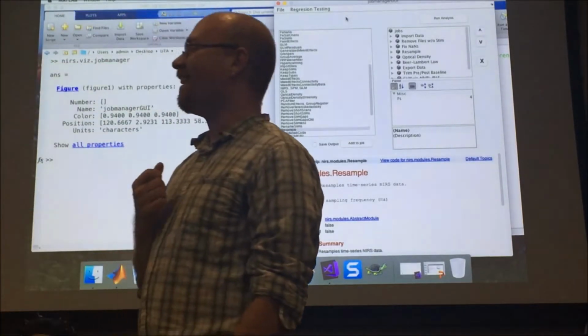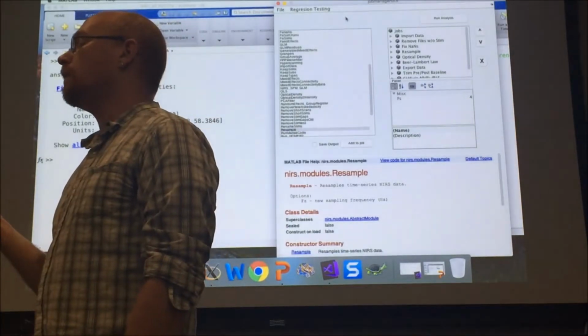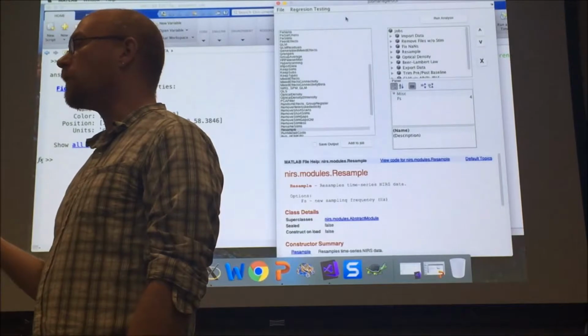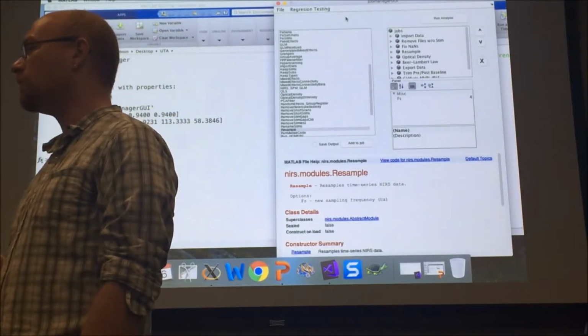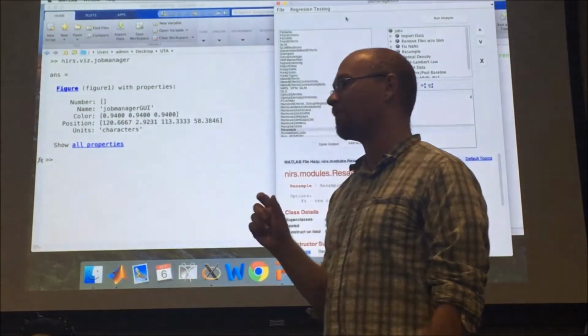I work with it. So. Well, no, actually, the function that I use to save figures, LaTeX actually is one of the options. It's just not one of my defaults. I think my default is probably EPS, but I'm pretty sure I can do multiple different types.